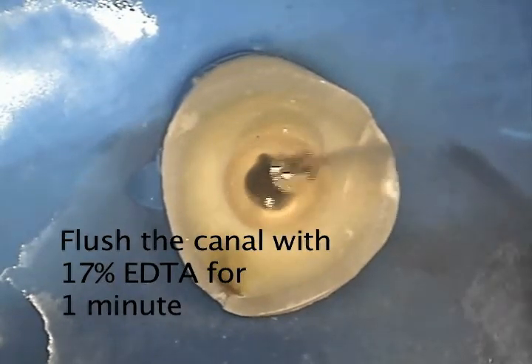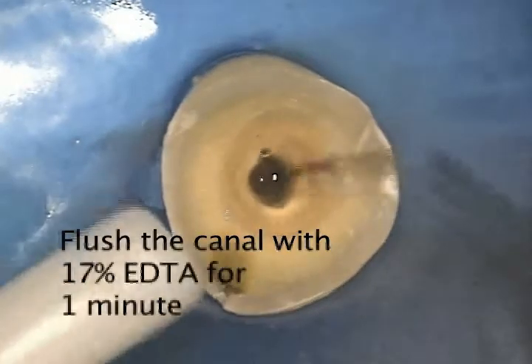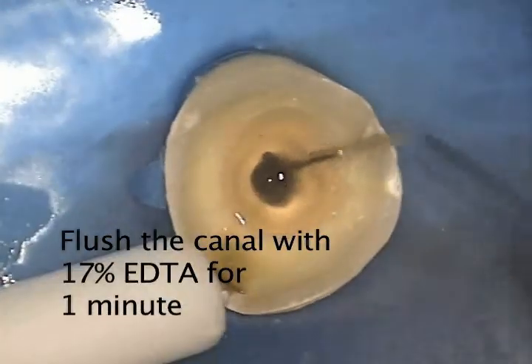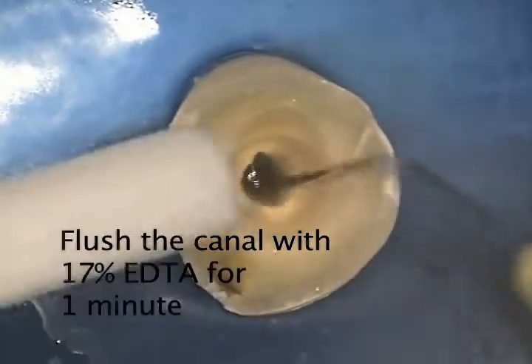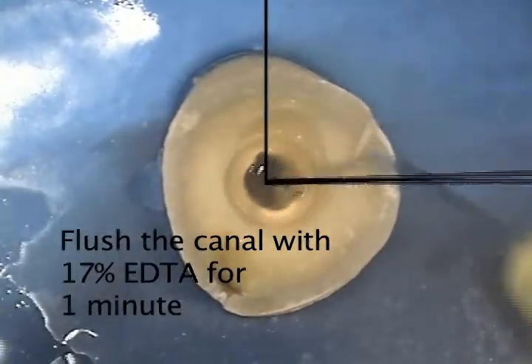To bond the post to the dentin, we flush the canal for one minute with Essential Dental Systems 17% EDTA in water. The EDTA removes the smear layer and micro-etches the dentin to facilitate the bonding of Essential Dental Systems' self-curing FlexiFlow reinforced composite cement to the dentin.